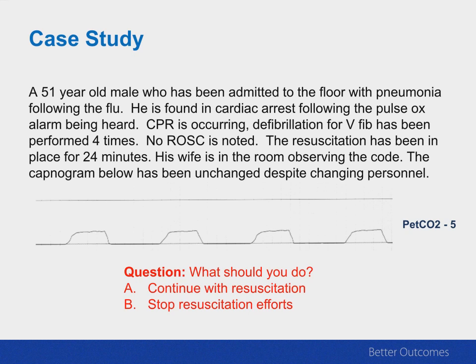Let me give another example. This is a 51-year-old gentleman admitted with pneumonia following an episode of the flu. He's found to be in cardiac arrest after the pulse ox alarm is heard. CPR is occurring, and defibrillation for ventricular fibrillation has been performed 4 times. There's been no return of circulation noted.